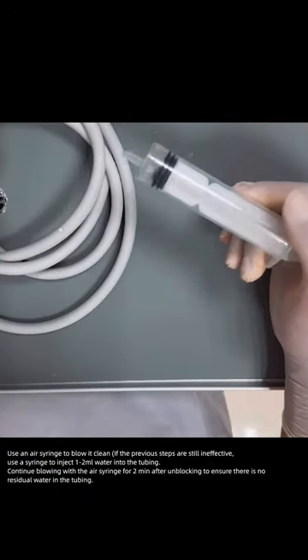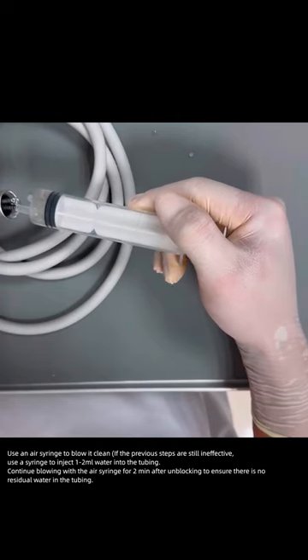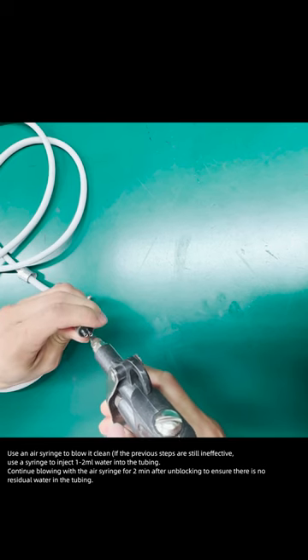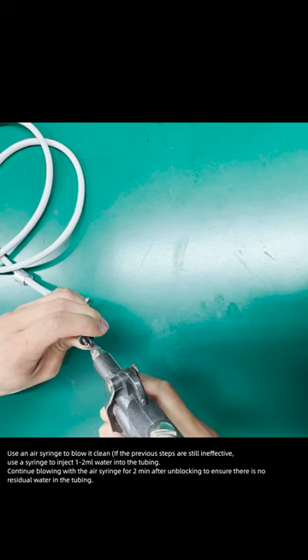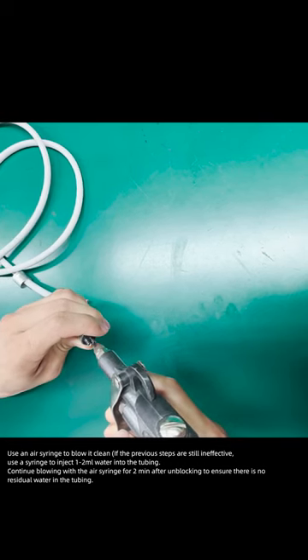Use the air syringe to blow it clean. If the previous steps are still ineffective, use the syringe to inject 1-2 ml of water into the tubing. Continue blowing with the air syringe for 2 minutes after unblocking to ensure there is no residual water in the tubing.